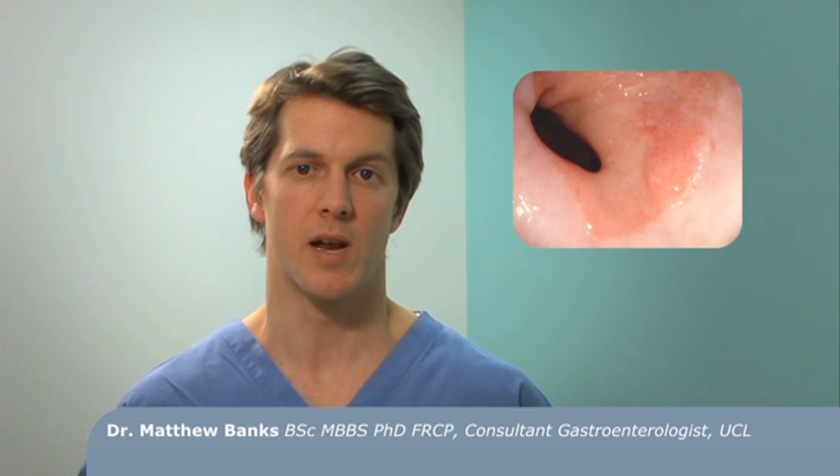Surveillance of Barrett's requires painstaking mucosal visualisation in order to try and pick up any small areas of early neoplasia, which constitutes both high-grade dysplasia and intramucosal cancer. Using the Highline system, you are more likely, in my opinion, to detect these very small early cancers or small areas of high-grade dysplasia.